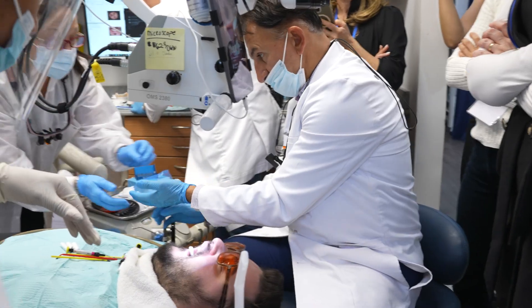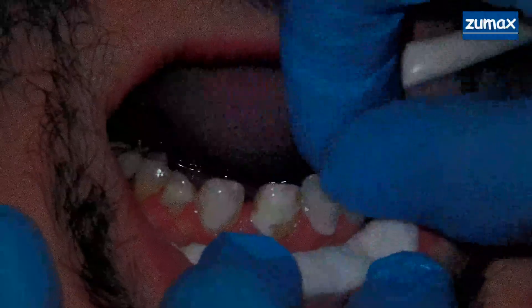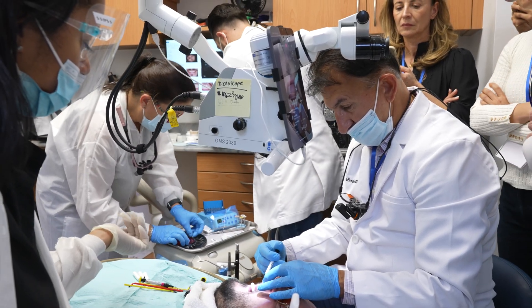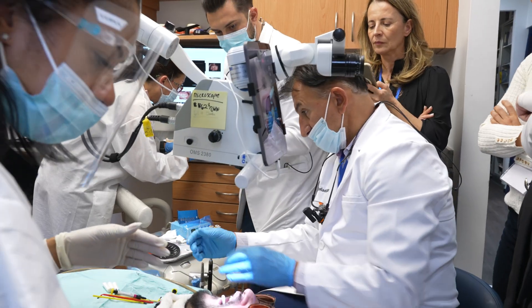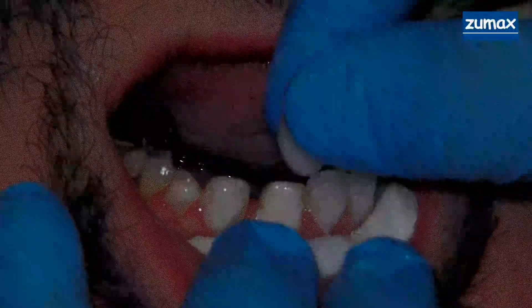Where is XL2? 7 is in. XL4 on 8. See XL2? It's a little lighter. Number 8 is in.